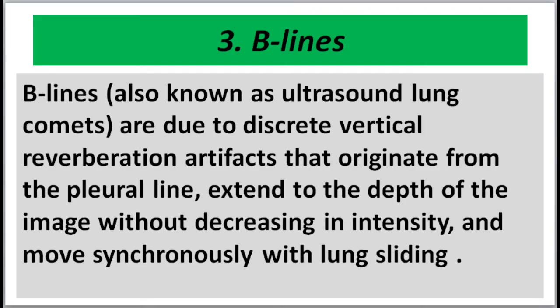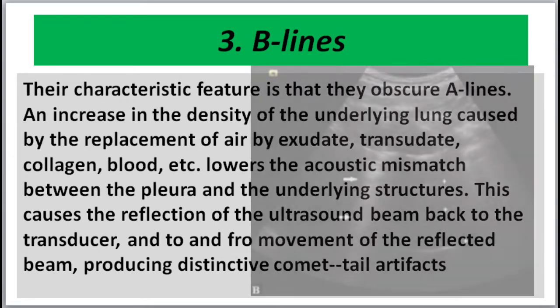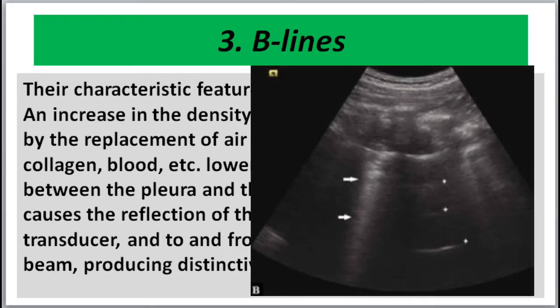B lines, also known as ultrasound lung comets, are discrete vertical reverberation artifacts that originate from the pleural line, extend to the depth of the image without decreasing in intensity, move synchronously with lung sliding, and characteristically obscure A lines.